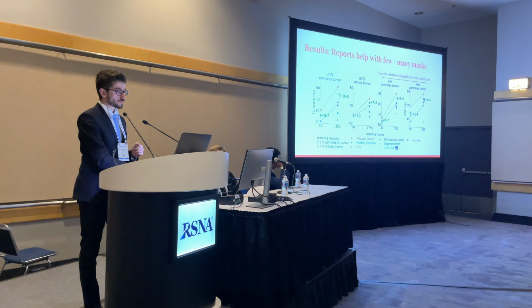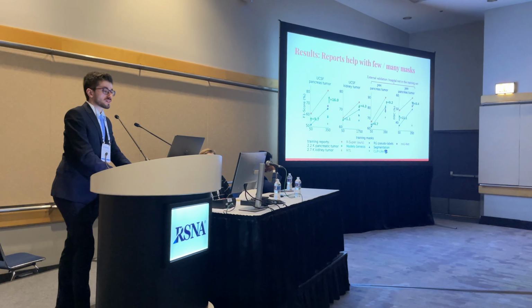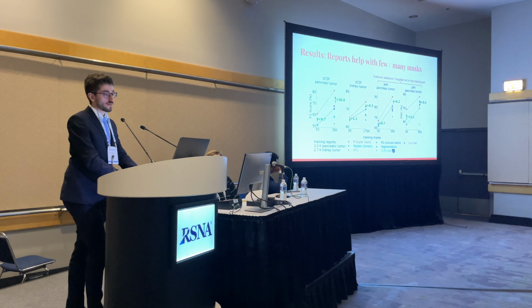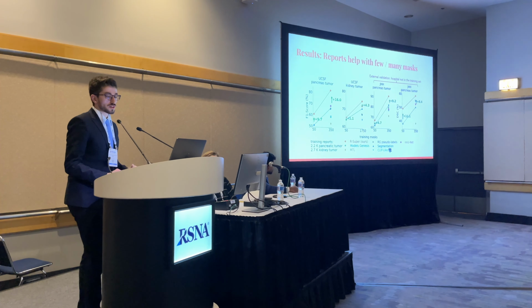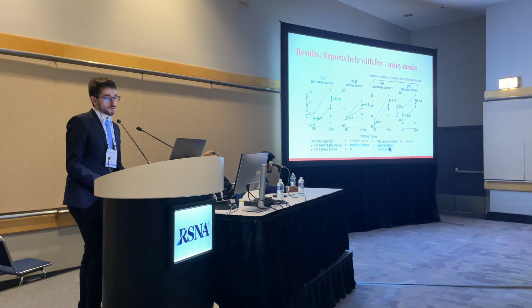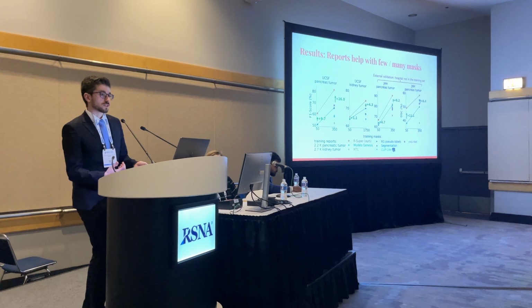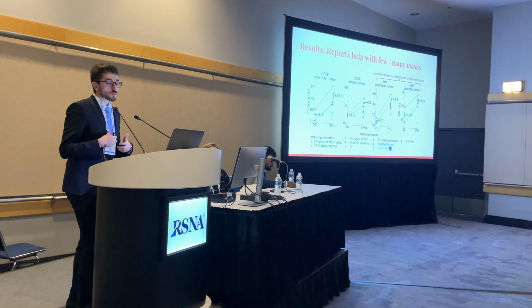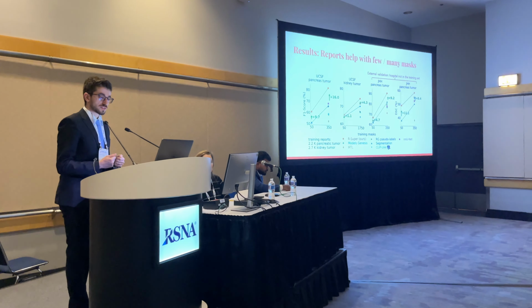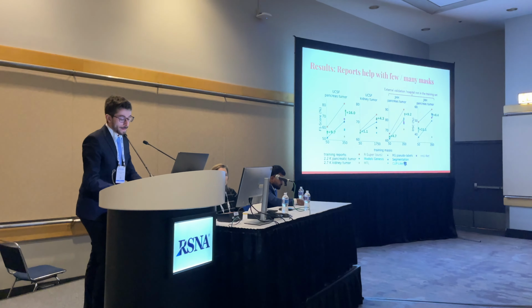So now some results. We have compared our model to many alternatives that can also learn from reports in some way. So for example, pre-training with CLIP and then fine-tuning for segmentation. And we see that our model is much more efficient in learning from the reports. So we achieve much higher results.